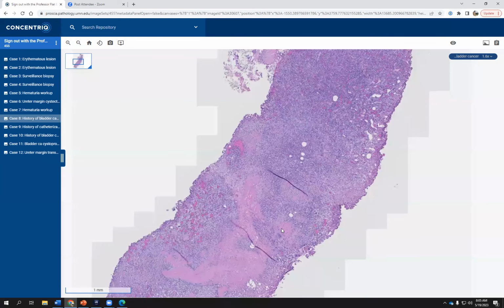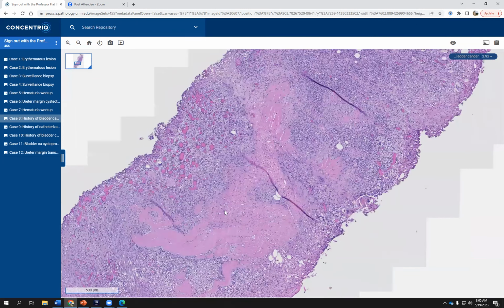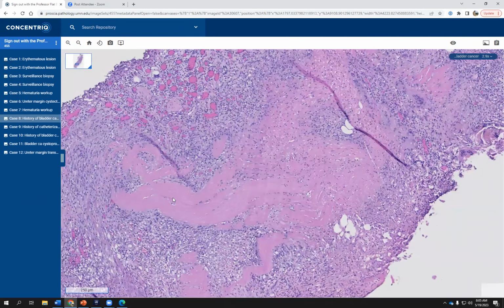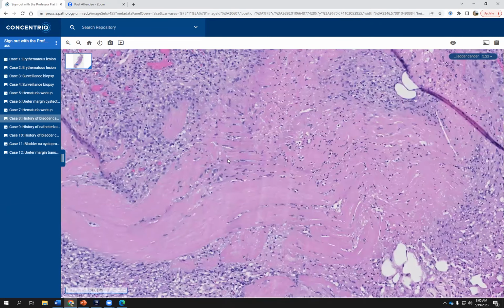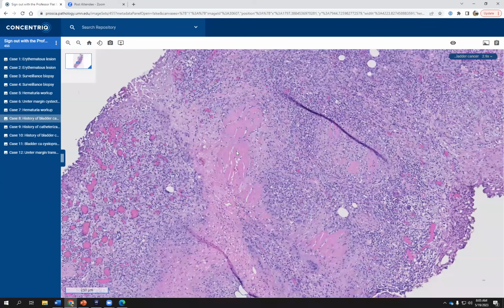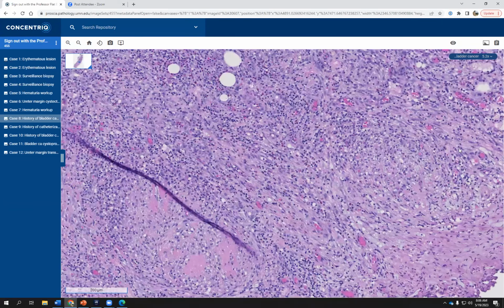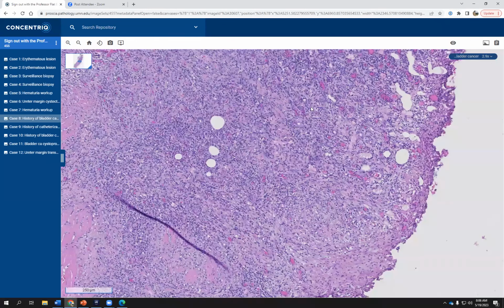So what are the changes we see here? These are essentially changes of injured tissue or a previous surgical procedure being done, right? So you can see here degenerating muscle, you can see some acute inflammation, and you can see tons and tons of blood vessels, some chronic inflammation, very characteristic of granulation tissue formation. You can also see a myofibroblastic proliferation in the background.